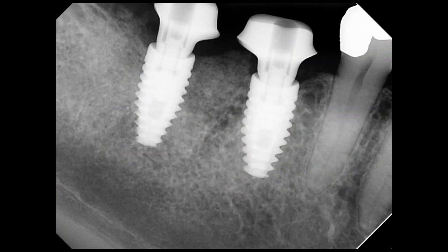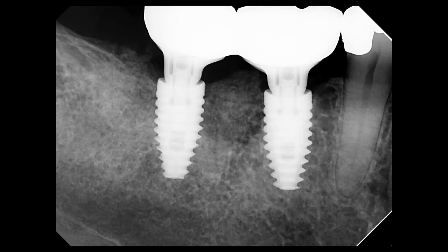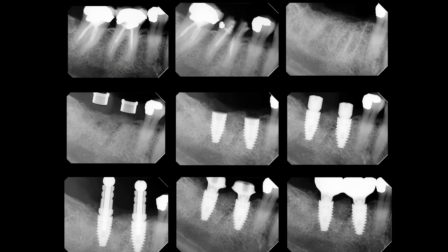And now we can go ahead, we'll verify that those are down, obviously. Notice this is a platform switch implant with their corresponding custom abutments. And then we'll go ahead and cement these final crown restorations onto the implant. So here you can see we've cleaned out all the glue.